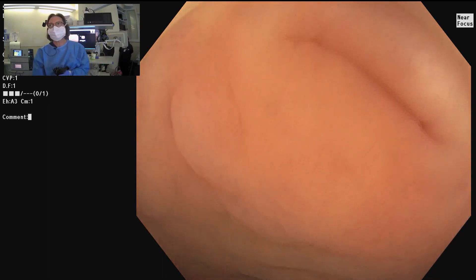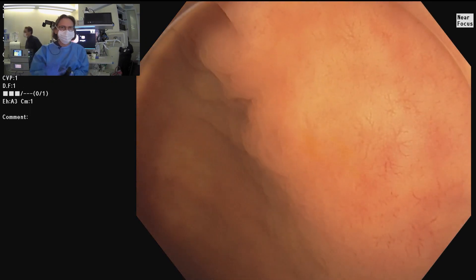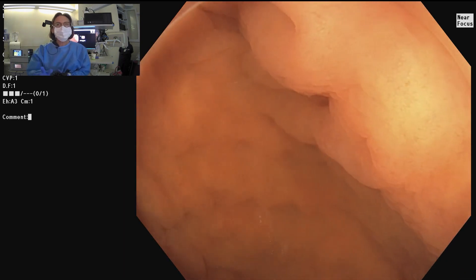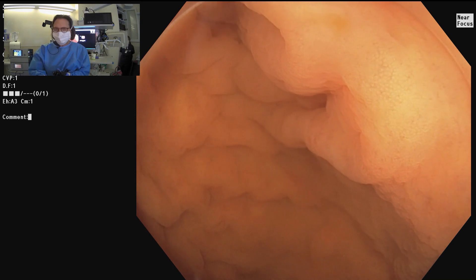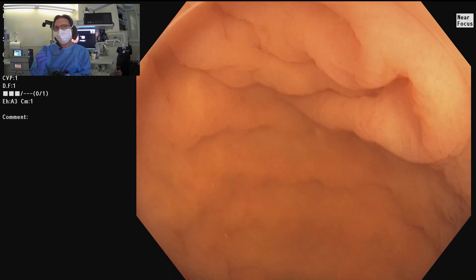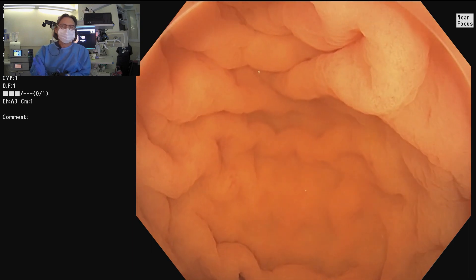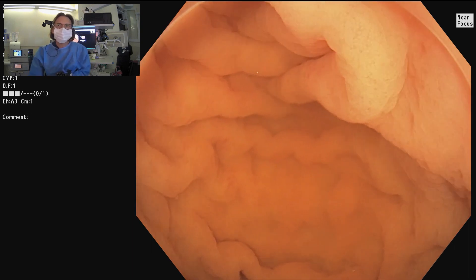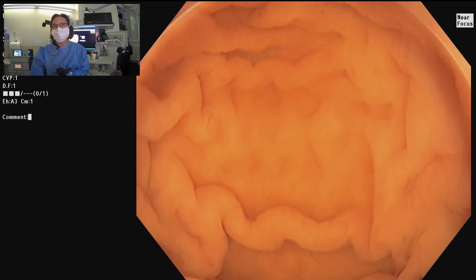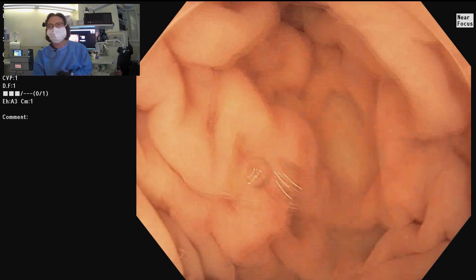It's saline. The reason for using saline is that plain water, for some reason, triggers the mucosa to secrete a film of mucus. It's not a problem if you're doing a quick procedure, but if you're in there for a longer period of time — for example, here we were waiting a while — everything would be covered with a thin film of mucus. That's why.